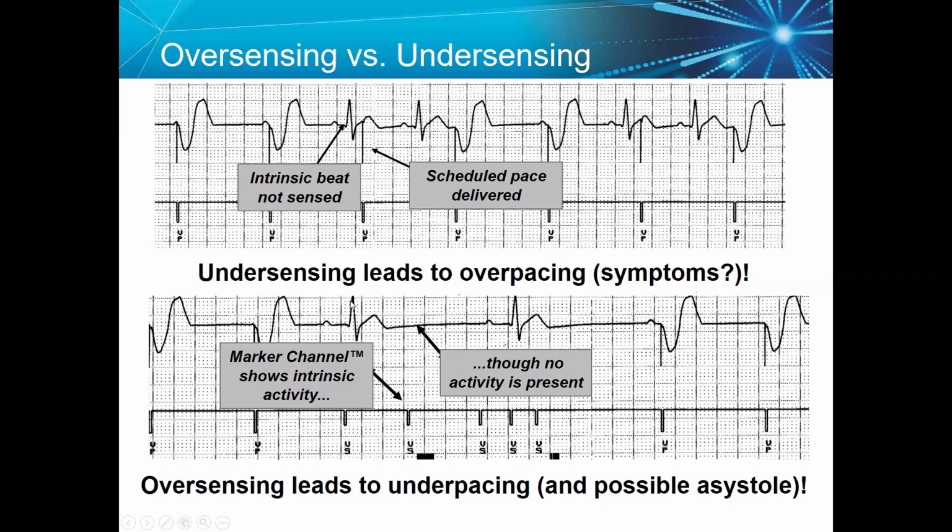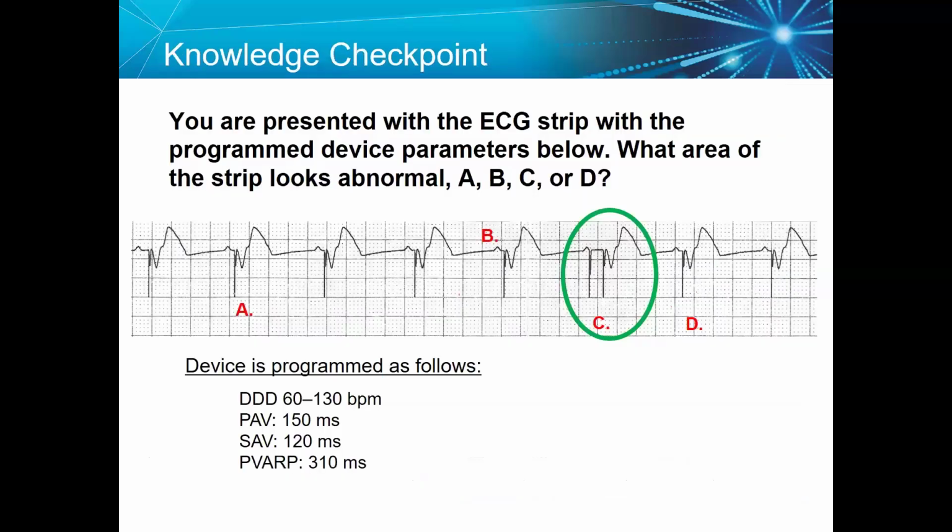It is very dangerous, so check the sensitivity to avoid oversensing and undersensing. Undersensing may cause arrhythmia because the ventricular spike will pace on the T wave, as it doesn't see that there is an intrinsic beat, and oversensing may cause inhibition of pacing. So we just be sure that sensitivity and sensing are appropriate.